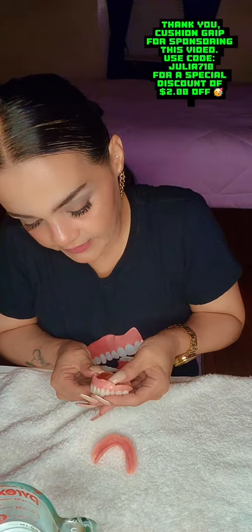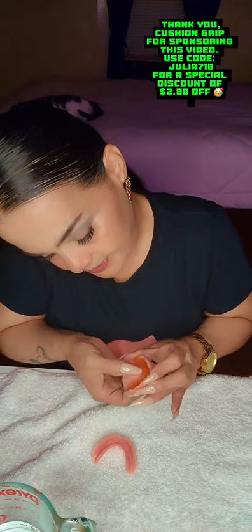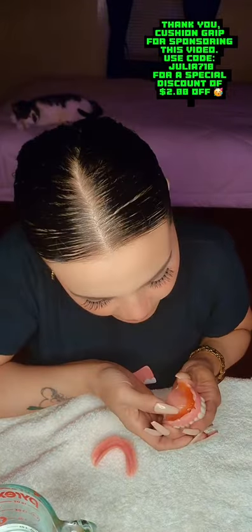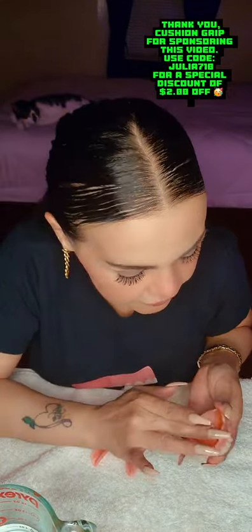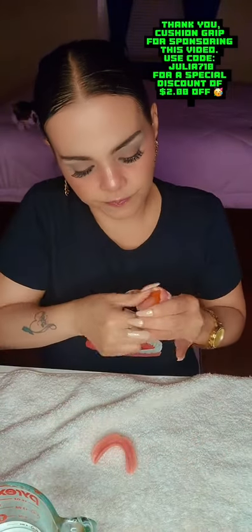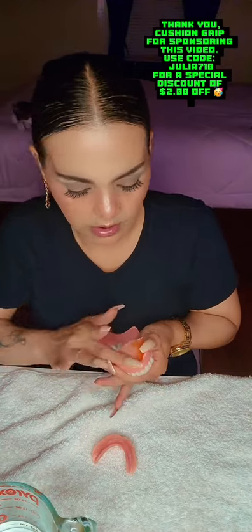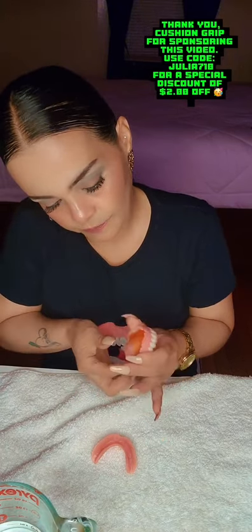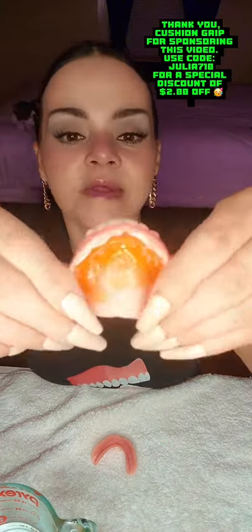Make sure you get all the tiny little crevices. Apply it in and make sure it's nice and applied, nice and secure. Put a little bit more into the middle of my palate and just spread it — just like that.